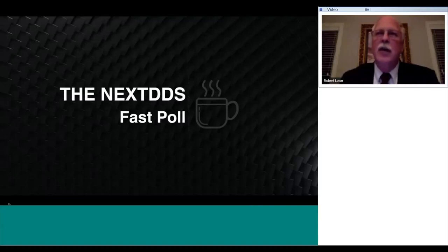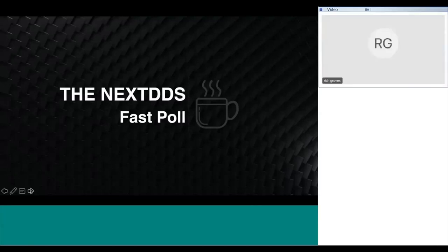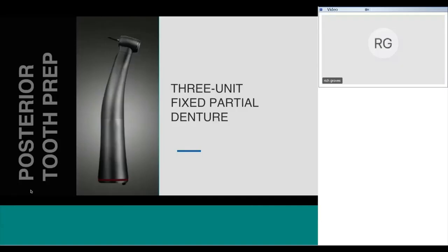The only reason I go under the tissue today is if I have a short prep and I need additional retention, or if I have a dark prep and I need to mask the darkness of the color to have an esthetic result. When I started in this profession 30 years ago, the answer was subgingival 100% of the time. So you see, times have changed, materials have changed. Now we're going to tackle incisal gingival height, one of the questions we've already got from the audience, in more detail in just a few moments.